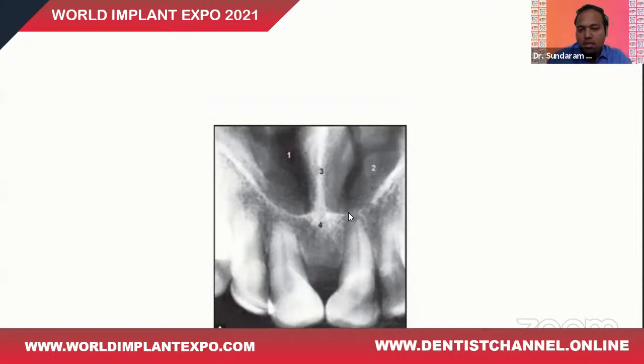Now, what about the teeth? The teeth come up to the floor of the nasal cavity, and even then, it's because of the improper angulation. I will not be able to say precisely, if I'm going to place an implant over here, where and how and what dimension of implant I would be putting over there.